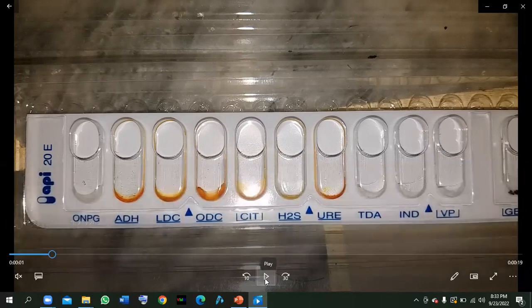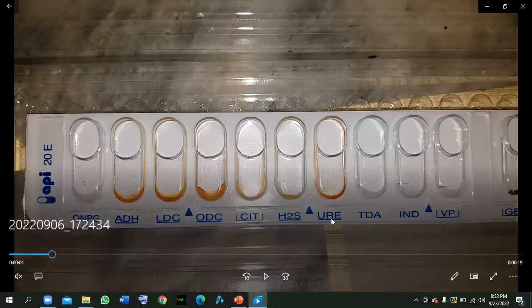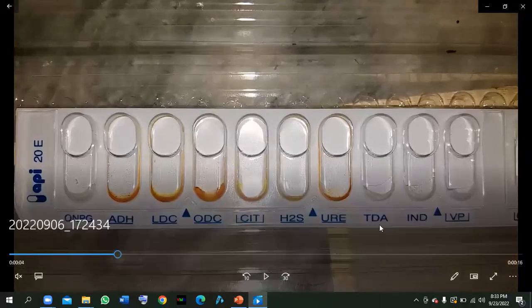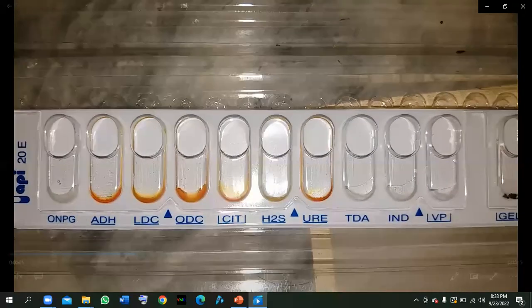This is also for the H2S, and this is also for the urease, and we proceed further. Just look here, here is the TDA. This TDA does not have any straight line or curved line. So this means just fill it up to here and leave it. You are not to fill the entire well with your inoculum, and you are not allowed to fill it with immersion oil. So keep these three points in your mind.